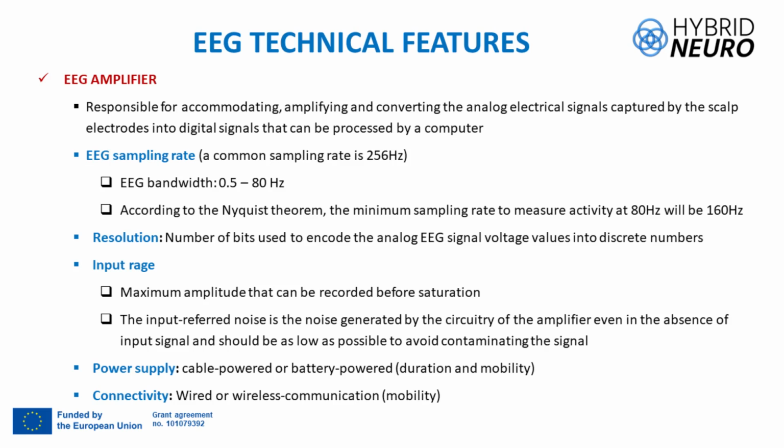When I see a study where they record at 2 kilohertz or 5 kilohertz for the sampling frequency, probably I think, okay, maybe you don't know a lot about EEG recordings, because it's totally not necessary. Well, the resolution, as in any potential, 16 bits or more bits is better.